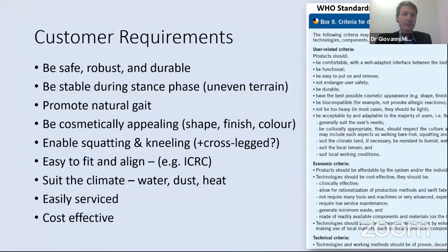prosthetics. The one factor which I thought was very interesting, someone commented that the cosmetic appearance of the device, and the previous speaker has just mentioned that with regards to the color of the feet and looking like a robot, can actually have an impact on the patient's mental health. If the person feels different, if their skin doesn't look natural, then maybe they will feel depressed.